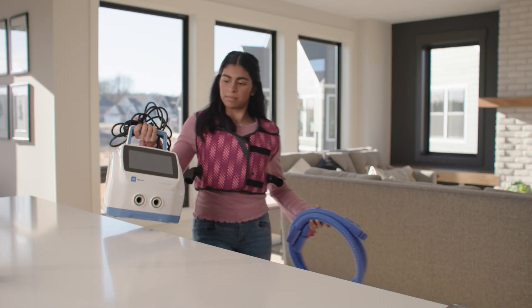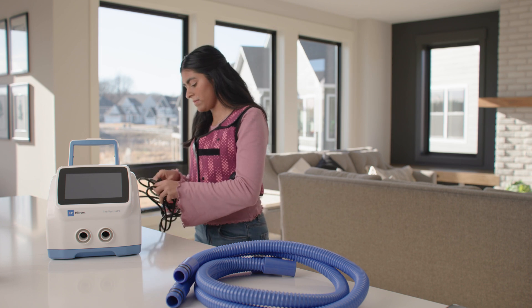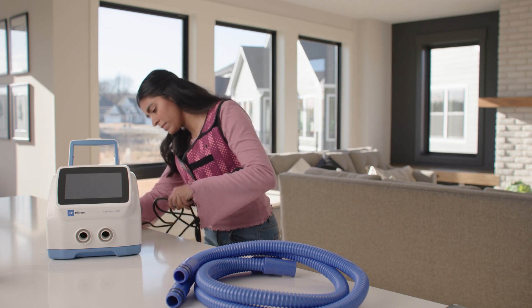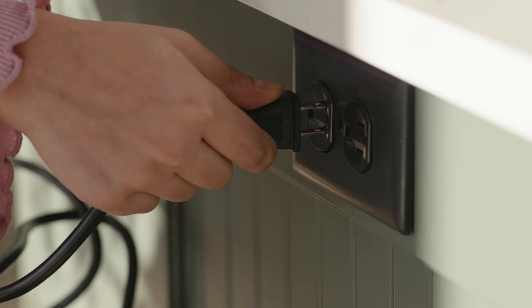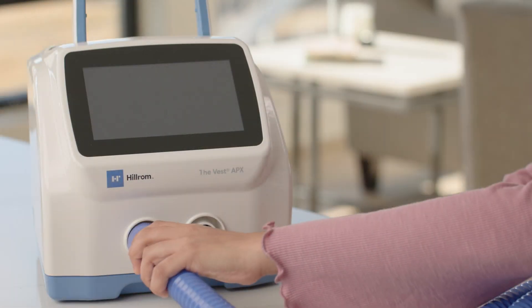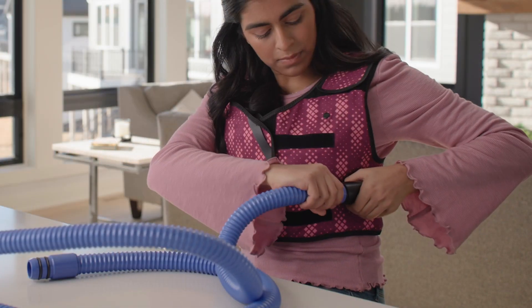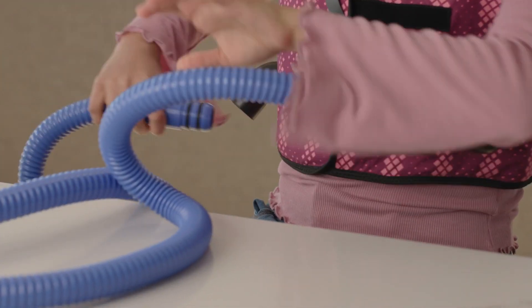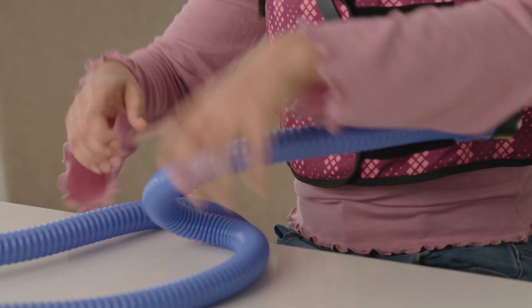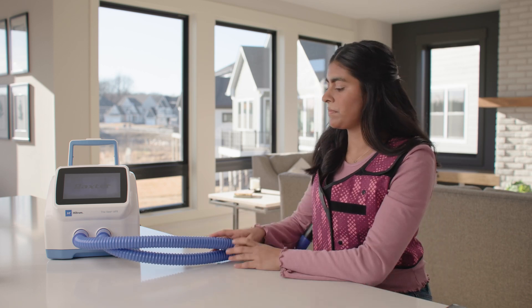Setting up your control unit is easy. First, place it on a dry, flat, and hard surface away from curtains, blankets, or any heat generating devices. Insert the power cord into the power inlet on the back of the control unit and the plug into an applicable power outlet. Slide the metal ring end of each air hose into each air hose port on the front of the control unit. Slide the double O-ring end of each air hose into the air hose port on the garment. Slightly twist the hose while pushing it into the garment air hose port to make sure it is correctly inserted. You are now ready to start using your device.